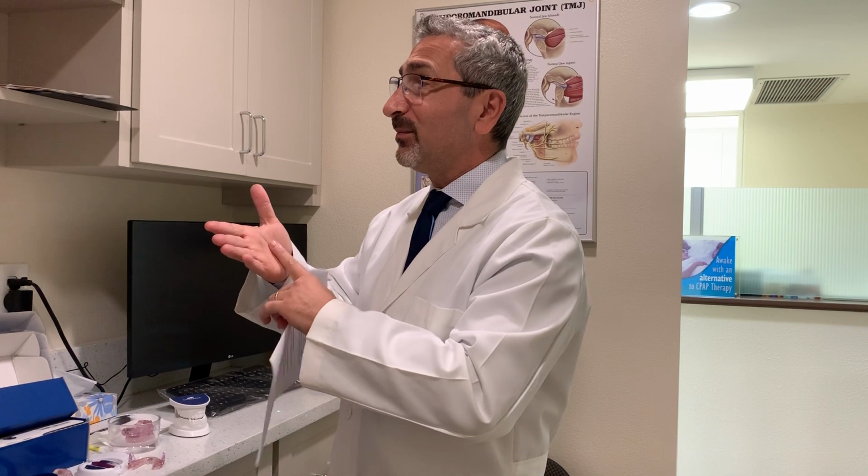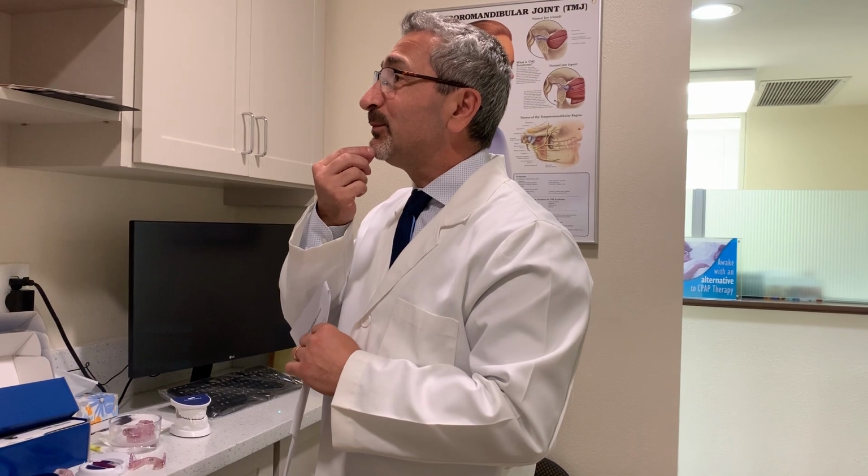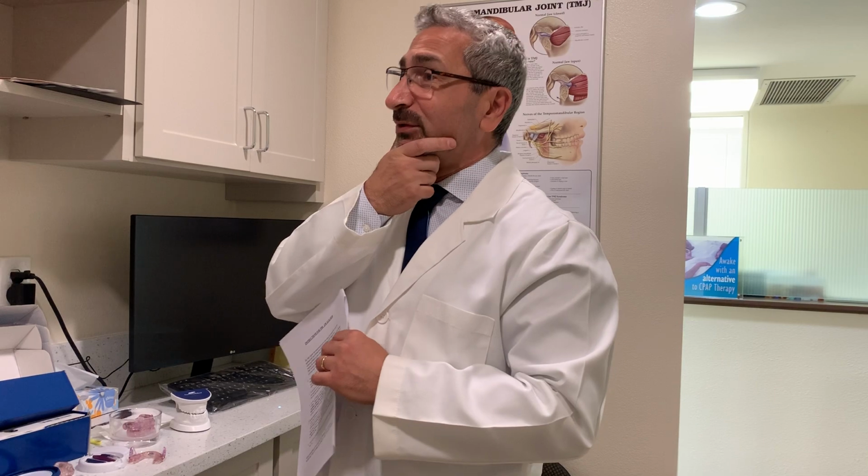The second one, I call it the chin rest. Basically, you're going to be using your palm, pushing your chin backwards. I'll just use my fingers to demonstrate. As you push back and bite on your back teeth, you're pushing your joint back into place there.